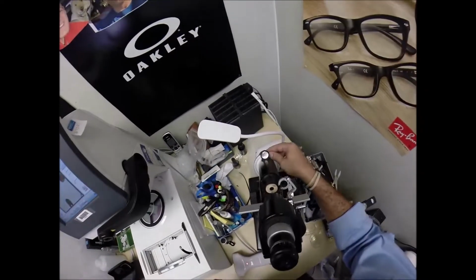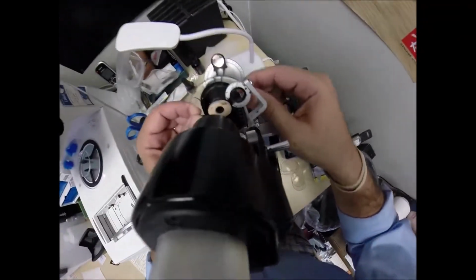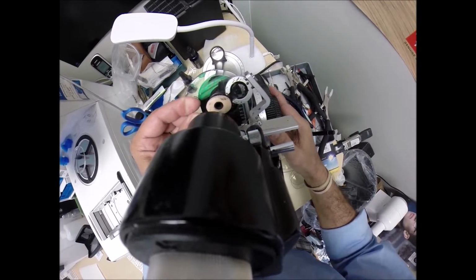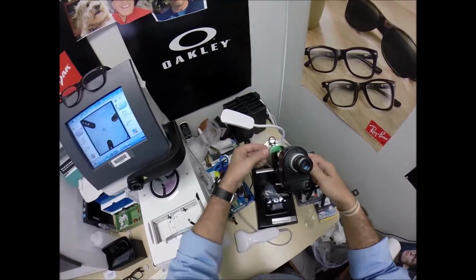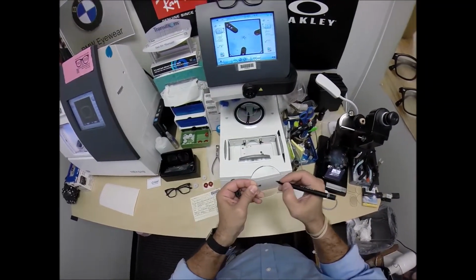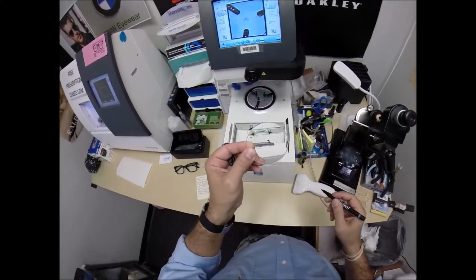Okay, get serious. Turn the axis wheel to 179 for the left eye. Don't have to change the power drum. It's still on plano, which is no power. Find the spherical power of the lens first, which is no power. Find the astigmatism correction. Put 3 dots on the lenses. Darken that. I'm going to put an L on here, which is Latin for not right.